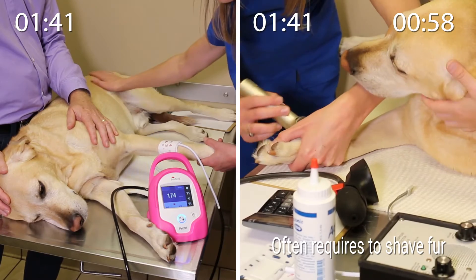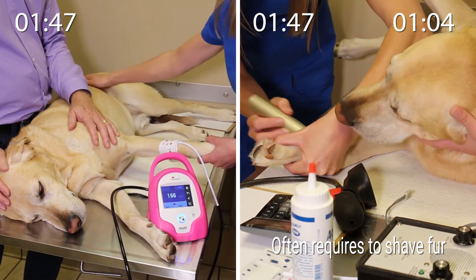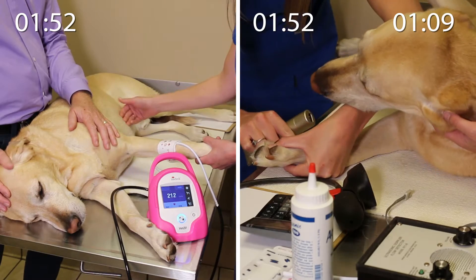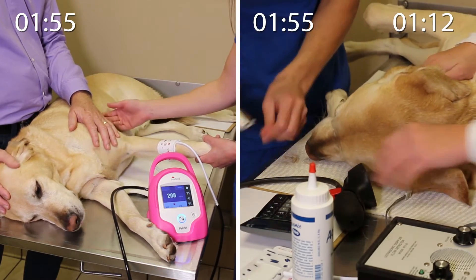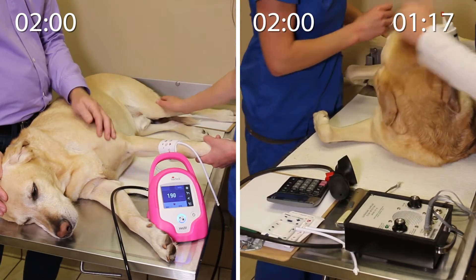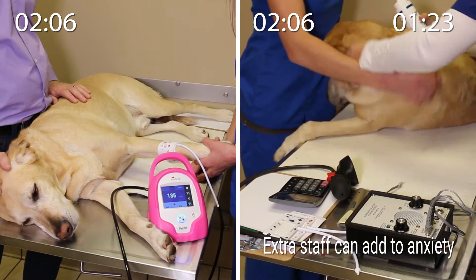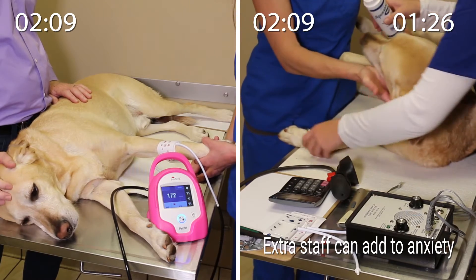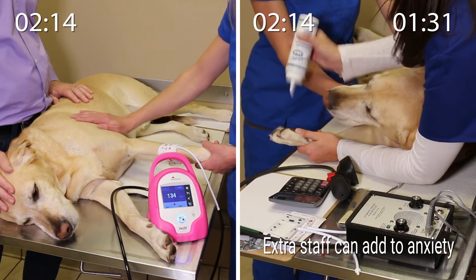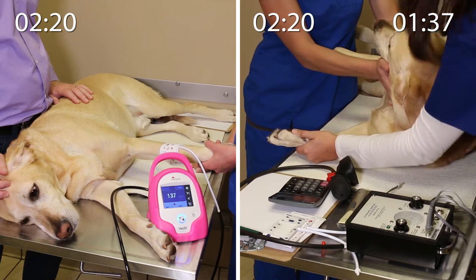On the right side, you'll see the technician shaving Tucker's fur. Trimming or shaving the fur, while usually not appreciated by the owner, can help get a more accurate measurement when using the Doppler method. Next, the technicians apply acoustic gel to the shaved measurement site and attempt to place the crystal over the artery. Extra attention is needed to make sure the crystal is placed right over the artery.